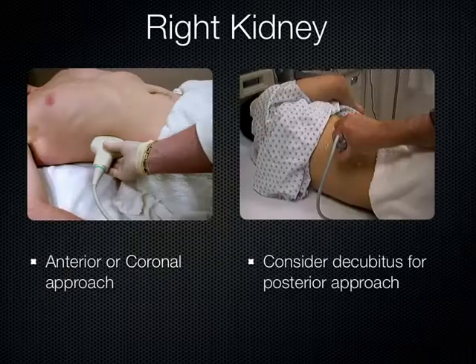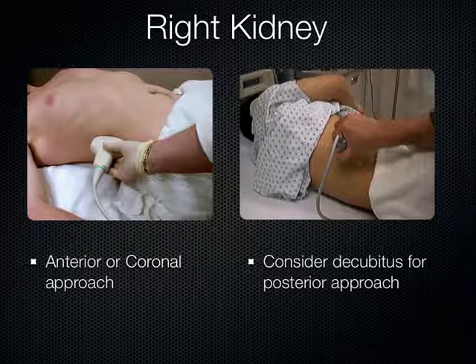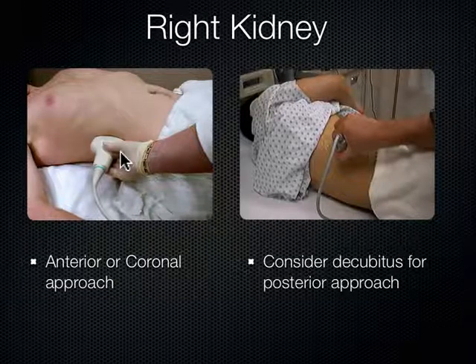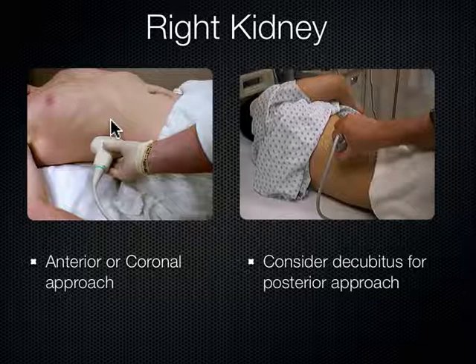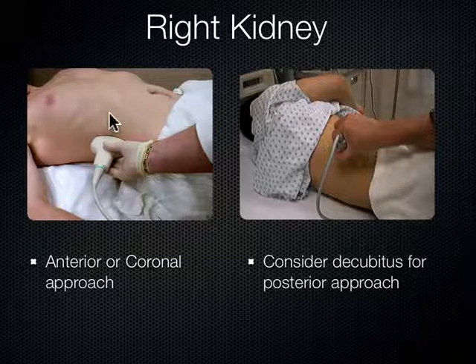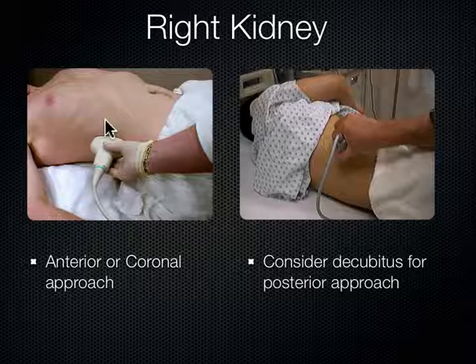There are a couple ways to look at the kidneys. You can come from the side of the body — coronal approach — and often get great views right away. Occasionally you need to drag the probe anteriorly, but since the kidneys are still a posterior structure, you'll also want to fan the probe posteriorly — tilting the cable towards the ceiling, shooting sound more posteriorly. Many times that anterior approach, using the liver or spleen as your window, is actually better than a coronal view. Every patient is different — this is the art of sonography.